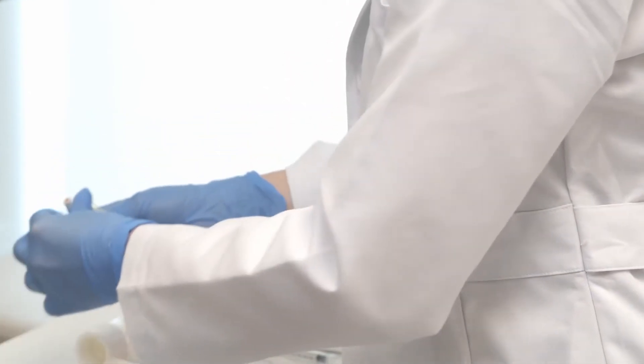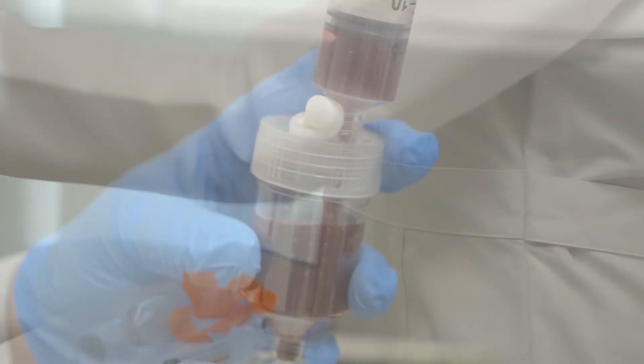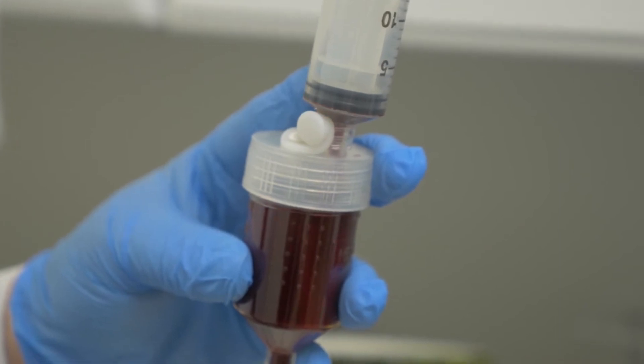The 30 ml syringe containing 23 ml of whole blood and 2 ml of sodium citrate are now ready to be transferred into the World PRP hourglass.